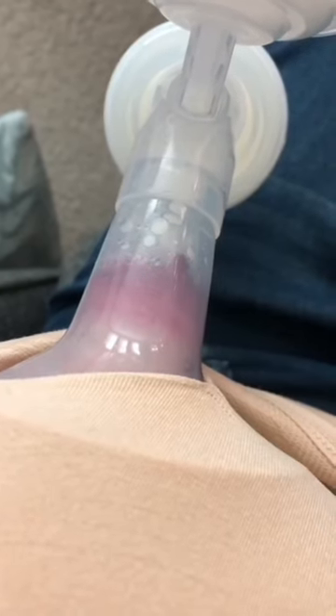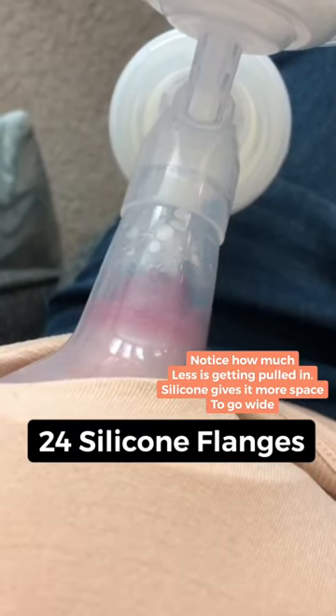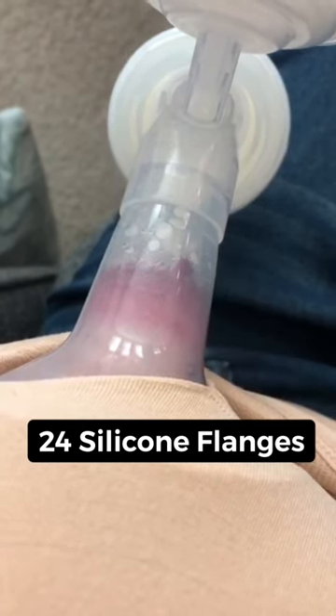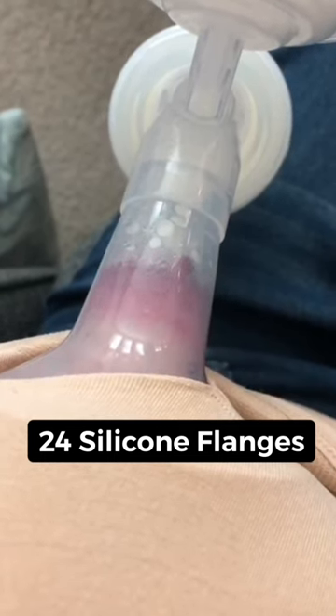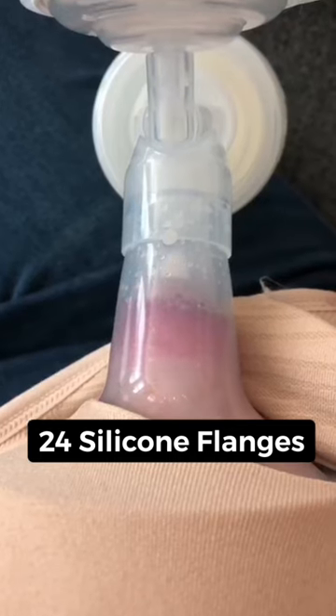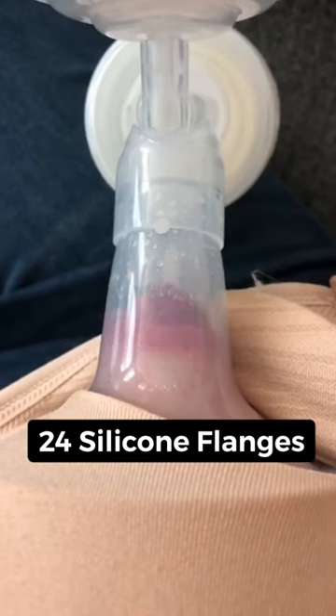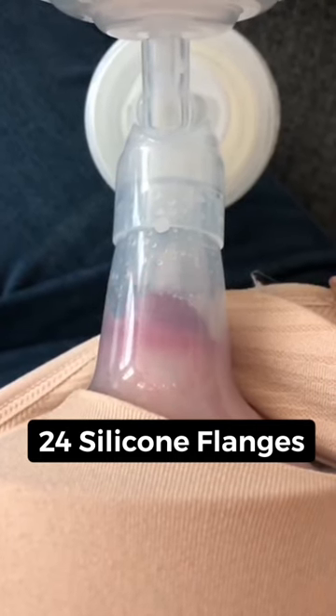Mom went ahead and ordered silicone flanges and sent me updated videos. She told me she's experiencing no pain anymore and is experiencing increased output. So very simply, you might have the right size, but if you are having very elastic nipples, silicone flanges might be the right option for you. These are the 24mm silicone, and mom reported back that she was very happy.